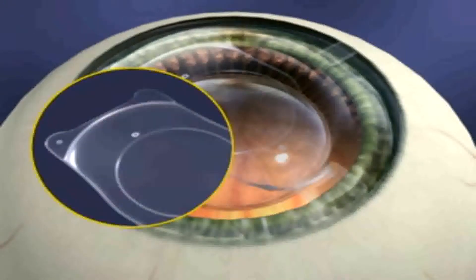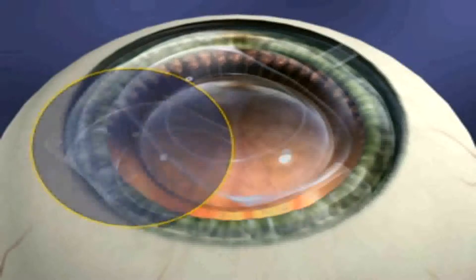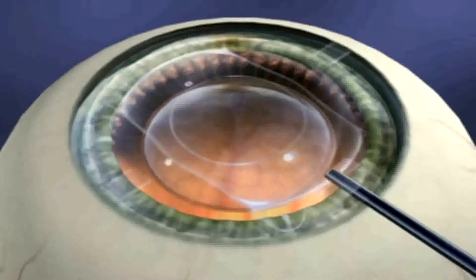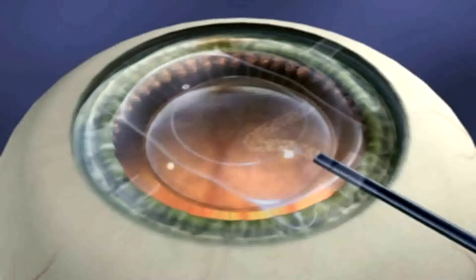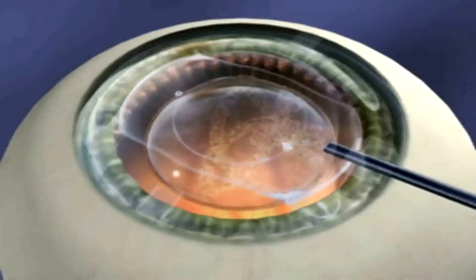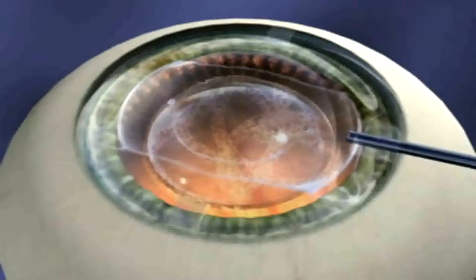If the ICL unfolds with the landmark on the left, it will be delivered upside down and will require removal, inspection, and reinsertion. Once the ICL has unfolded, inject additional viscoelastic on top of the lens to give yourself more room. Never inject viscoelastic underneath the lens.